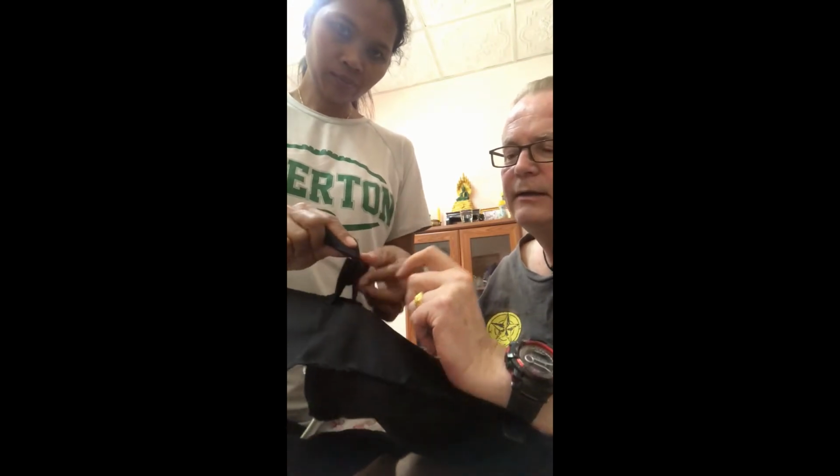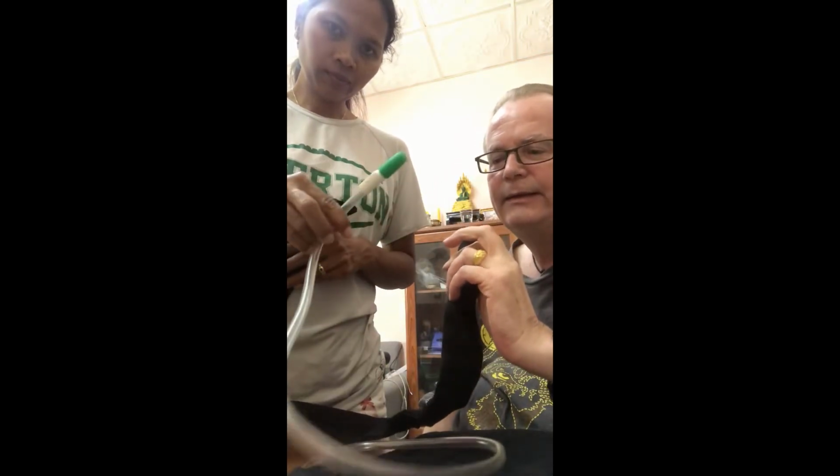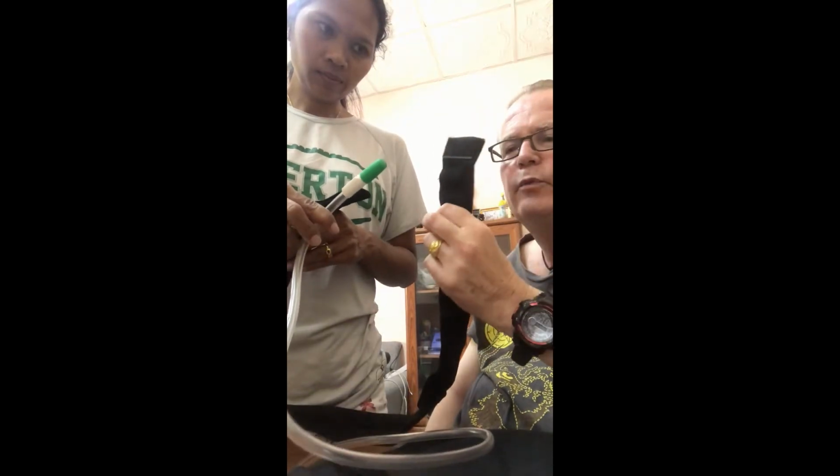Now the pipe, again, you'll see it attaches to the main bag by Velcro again, the hook and loop. It's the Velcro type hook and loop. So that's that again, so it's very, very easy to take off. Now with the pipe, we have chosen to actually put the hook and loop Velcro style all the way down the side of the pipe. But you don't really have to. You could just thread the bag pipe through here. But May's now going to open it up and show how we can attach it directly to the pipe.